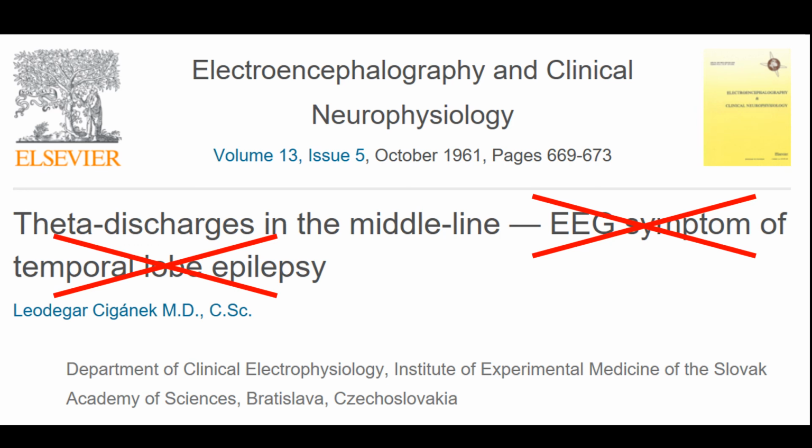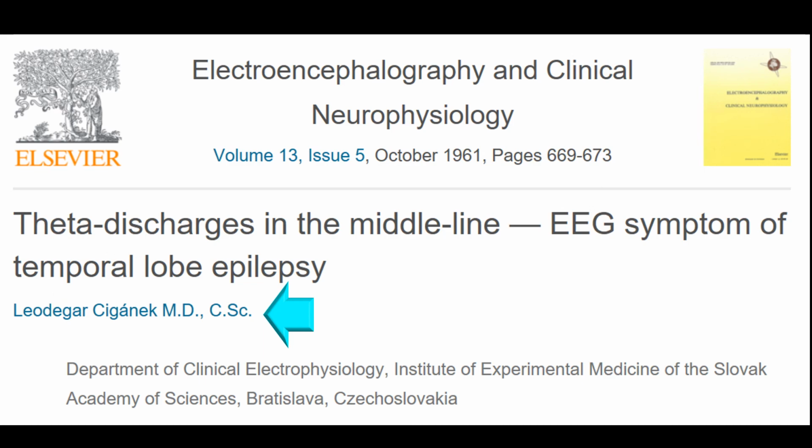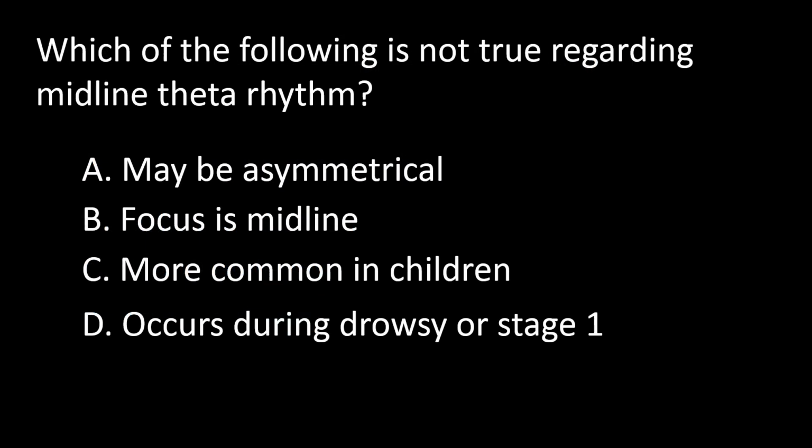So, despite the fact that the prediction that they were associated with temporal lobe epilepsy was not true, the name stuck. So the answer to this question is C.